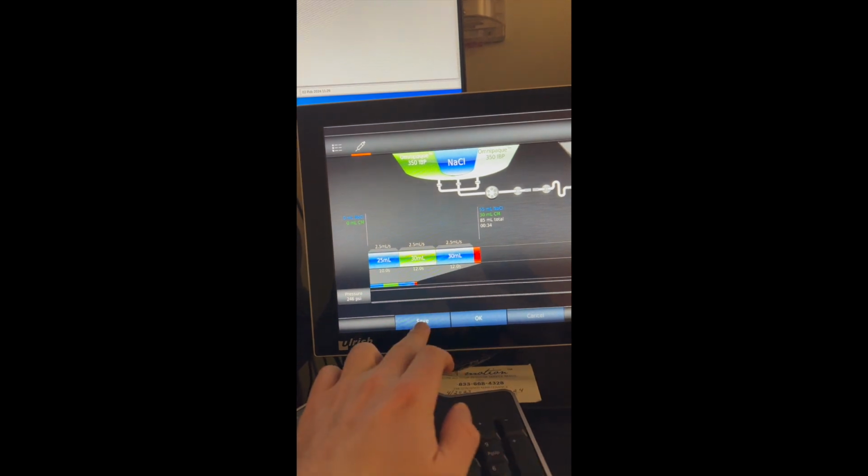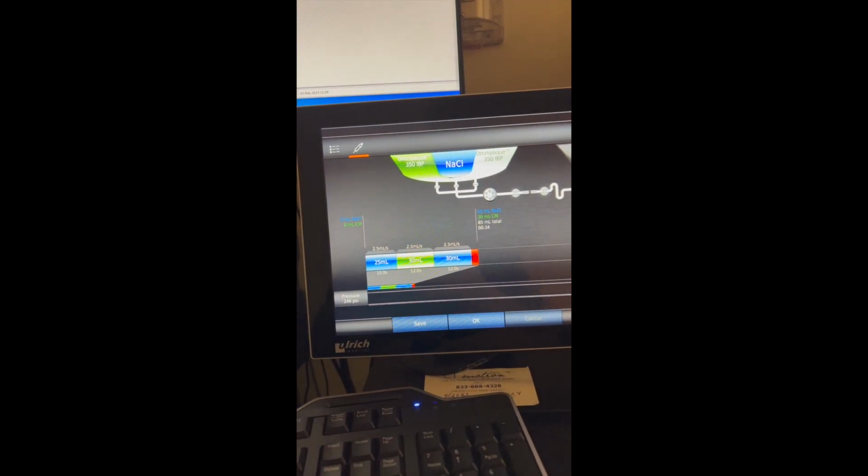Once you have that built, you can go ahead and click save. You can do whatever you need to.